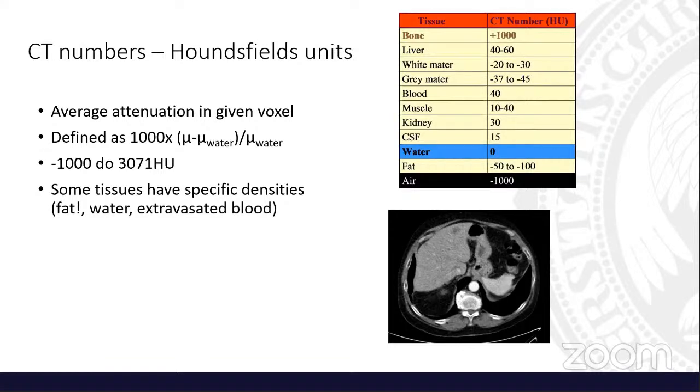If we put a shade of gray to each of that, it would be 4,000 shades of gray. Well, that's a sadomasochistic thing to do, much worse than 50 shades of gray, which we usually can see. That's why we need to take just some part of it. We need to take just some part of the voxels. That's called windows. We just take part of it to look at. That's something I'm going to talk about in the next slide.